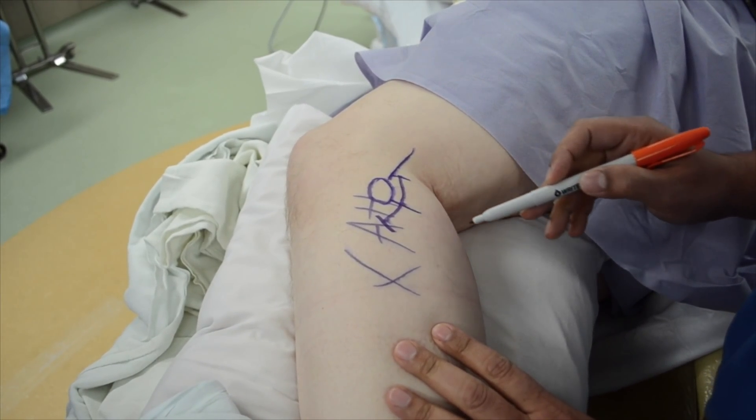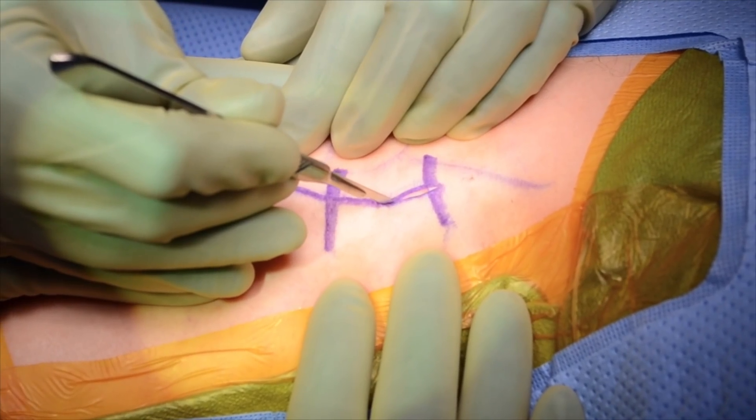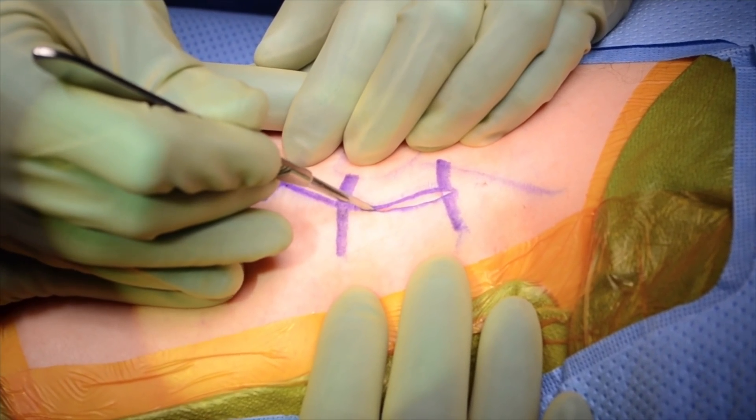The leg is then prepped and draped, and local anesthetic is infiltrated subcutaneously, taking care to avoid injection deep enough to contact the nerve.